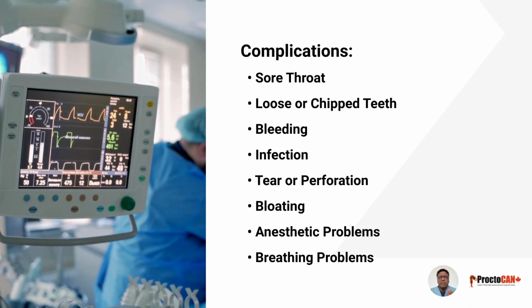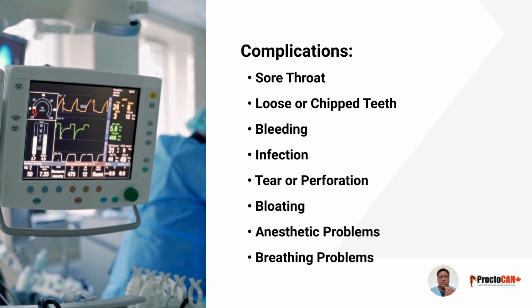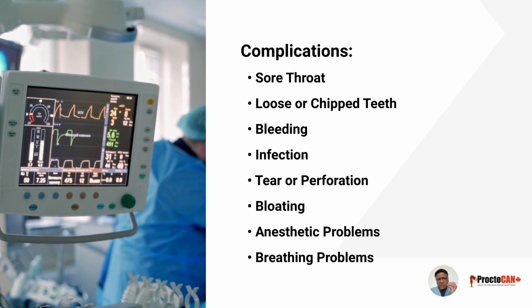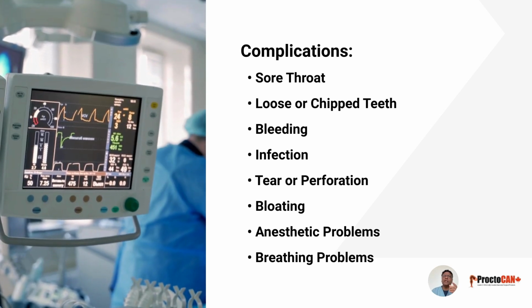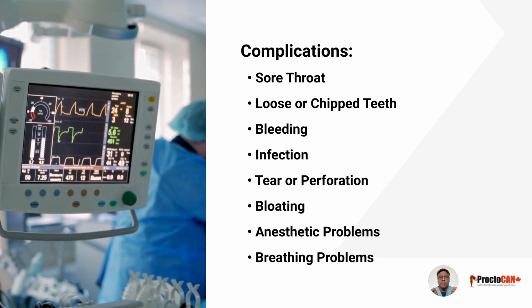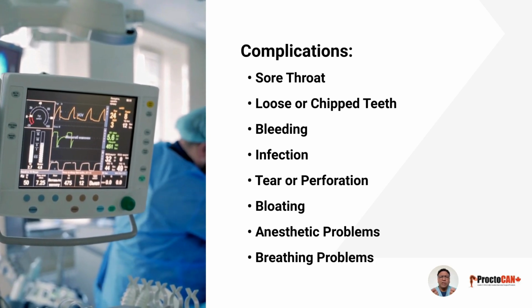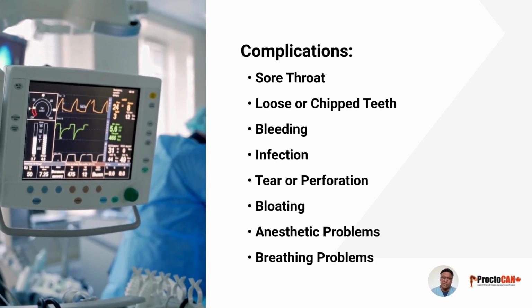Despite my best efforts to not hurt you, I may cause a complication to occur. While a gastroscopy is a safe procedure, it is essential to be aware of the potential complications and risks, or the likelihood of the complications occurring, as well as the alternatives. Although rare, complications may happen, which include a sore throat after the procedure, loose or chipped teeth from the insertion of the mouthguard and endoscope, and very rarely minor bleeding, especially if biopsies are taken.